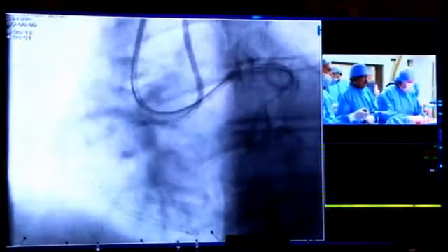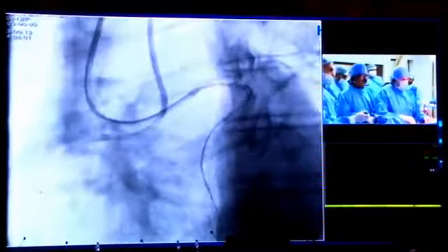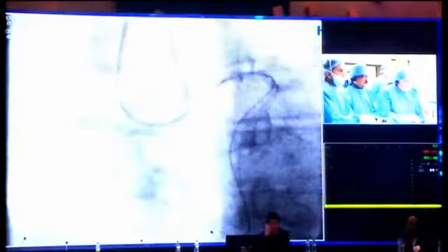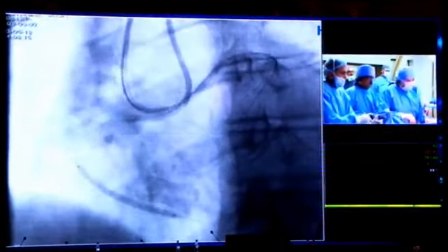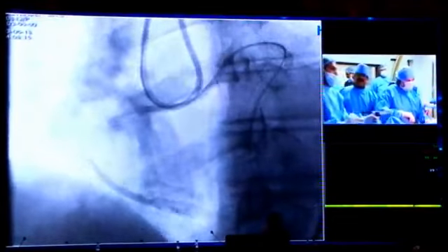So we go anyway with a 3.5 or maybe even a 4.0, approximately 3.5. Go up full, 18, 20, whatever, and see what kind of length of stent we need proximal. We probably need another 38. What is the length? Do you have an idea?